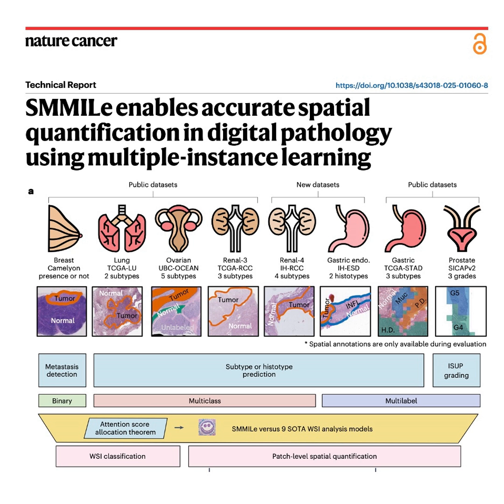So it's judging the group project as a whole, rather than interrogating the students one by one. I imagine that makes it pretty good at guessing the final grade. Oh, it is fantastic at predicting the overall slide label. But because it relies entirely on that broad slide-level label, its attention scores aren't directly tied to the individual patches. Oh, I see. Yeah, so it gets easily misled by confounding factors in the tissue. It overfits to completely irrelevant areas. So you get the correct diagnosis, but your map is practically useless.